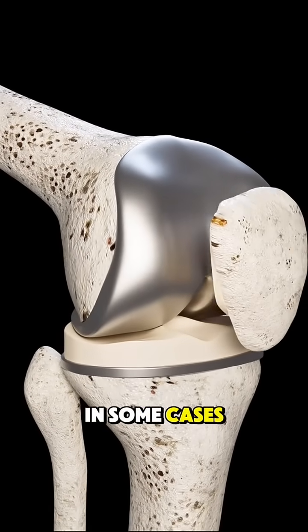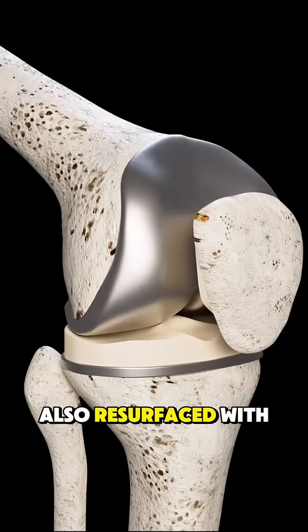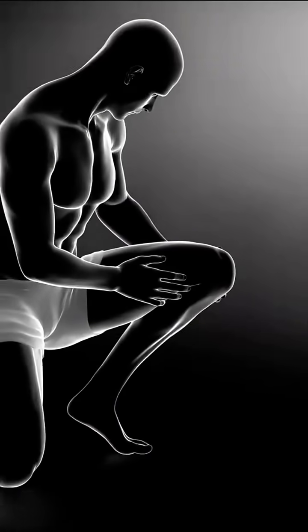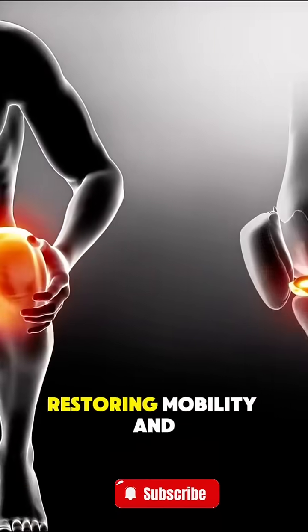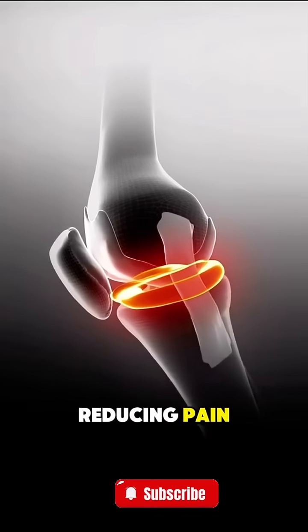In some cases, the underside of the kneecap is also resurfaced with a special implant. The artificial joint mimics the natural movement of the knee, restoring mobility and reducing pain.